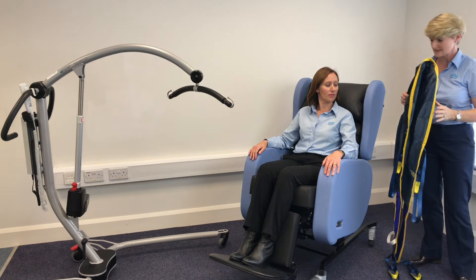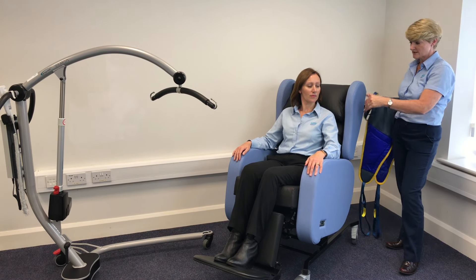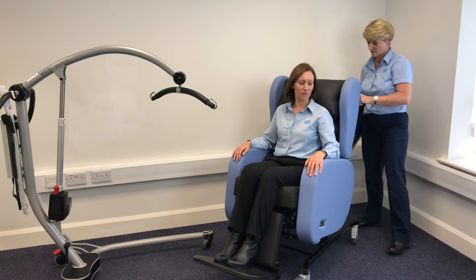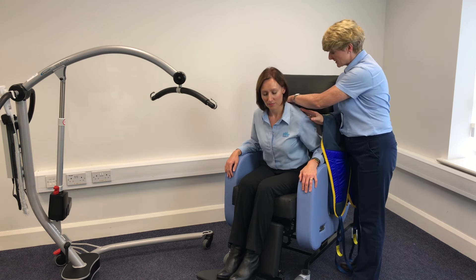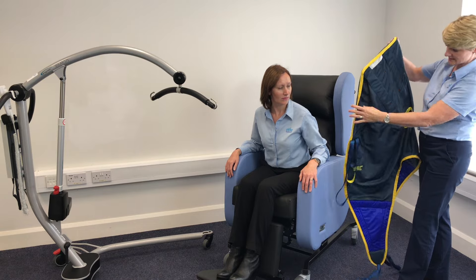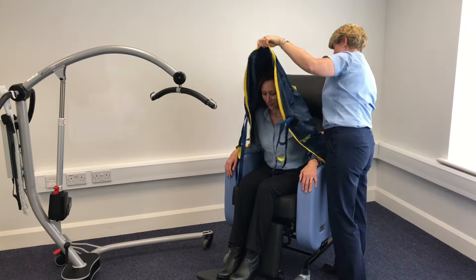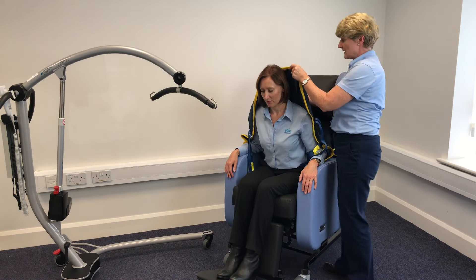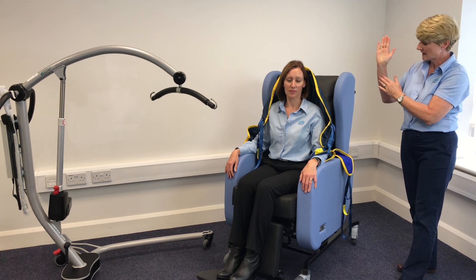A good way to start, if your chair is slightly reclined and in a slight tilt in space, is that rather than having to pull the patient fully forward, the chair is going to assist me in lifting Deirdre. So I'm just going to take some of the back angle recline off and also take the tilt in space off. With the armrests, my client can assist me in pulling herself forward. If it's a patient that's not able to do that, you may need help to put on the sling. There's an inside and an outside — the labels and any handles go on the outside. I usually place the sling down behind the patient and the bottom trim just slides down the patient's back. Where the patient's bottom meets the cushion, that's where you leave the sling. It's very easy to judge that angle with the City Matters chairs because there's clear demarcation between the back of the chair and the actual seat.